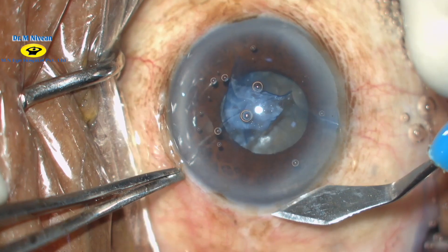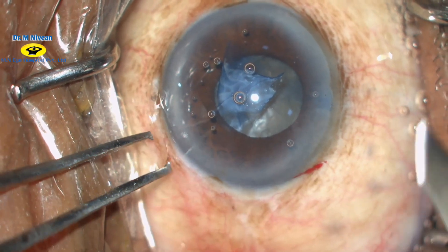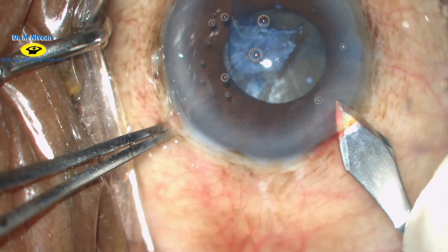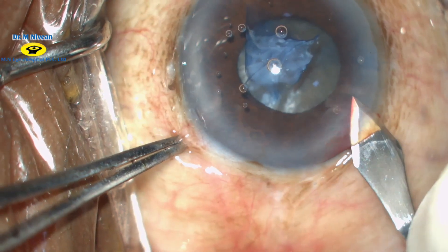An incision is made at the limbus with a 2.8 mm keratome, and a triplanar clear corneal incision is made with equal length and breadth to get a square incision.